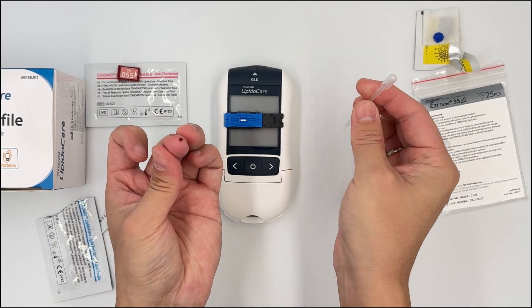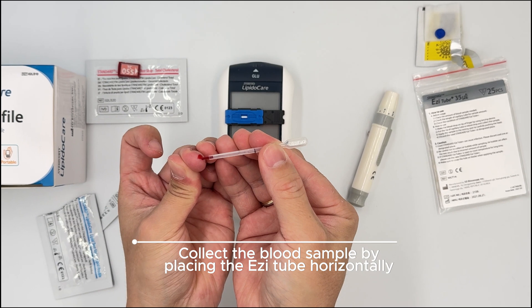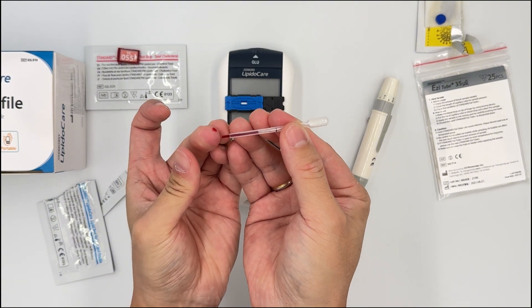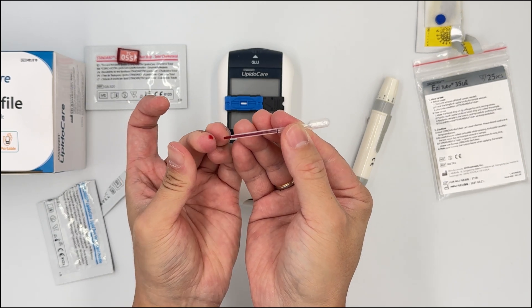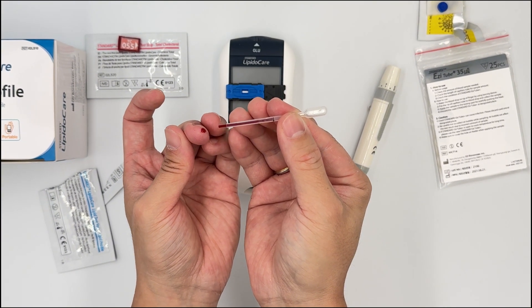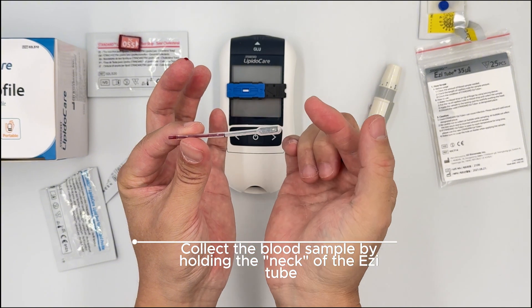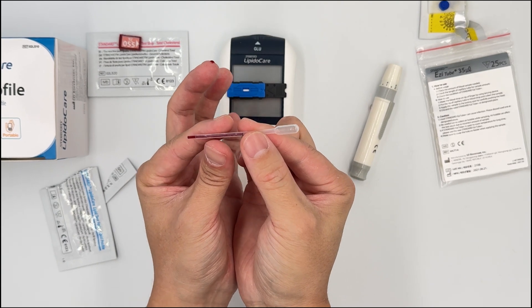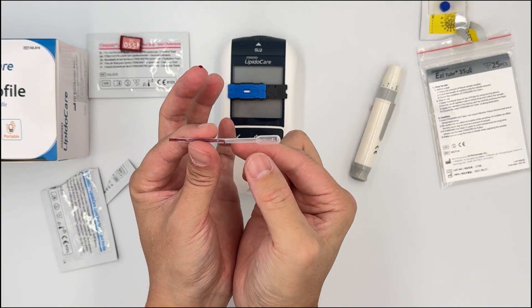You will see the blood — just press out a little bit. Then, very importantly, horizontally touch the blood and continue to massage the finger, or keep pressure so blood continues to come out. Massage a little more; the blood comes out until the black line and it will stop. Note that I am holding the neck of the easy tube, not the top, because holding the top blocks a tiny hole and prevents smooth suction.